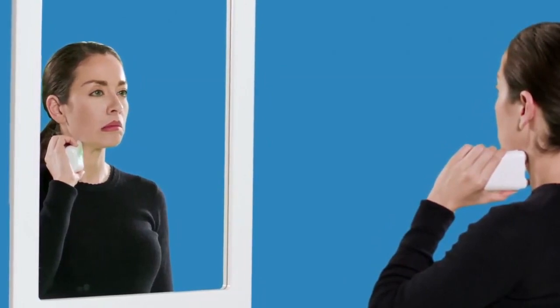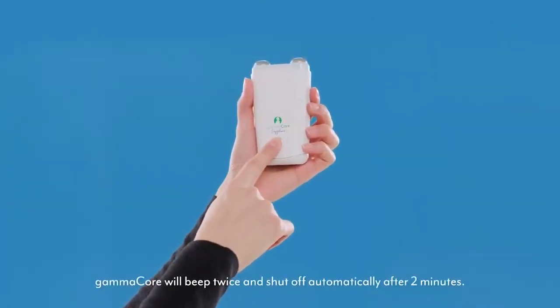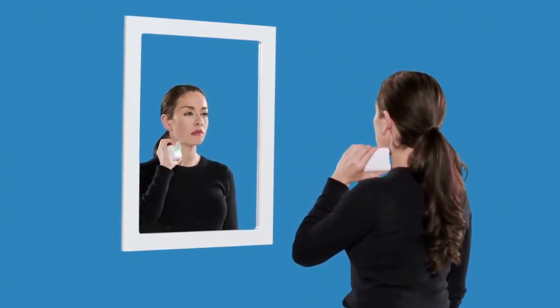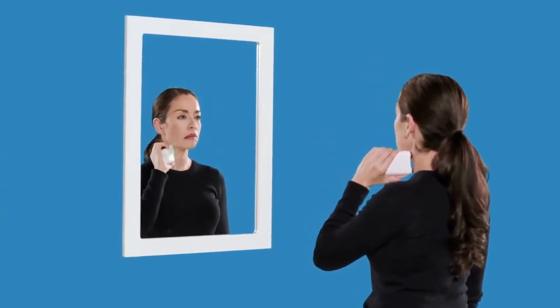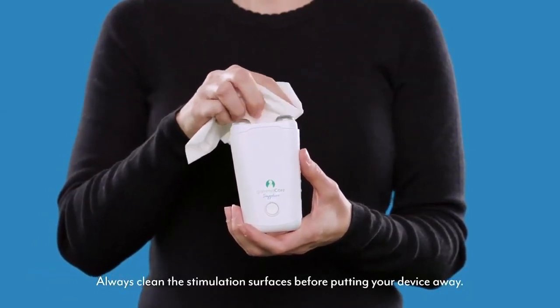After the stimulation is complete, your device will turn off automatically or you may turn it off by pressing and holding the power button. Perform your first few stimulations in front of a mirror to get a better feel for using GammaCore and to ensure you are correctly delivering the stimulation and to see the lip pull. After each stimulation, thoroughly clean the gel off the stimulation surfaces and off your neck. Reapply fresh gel before each stimulation.